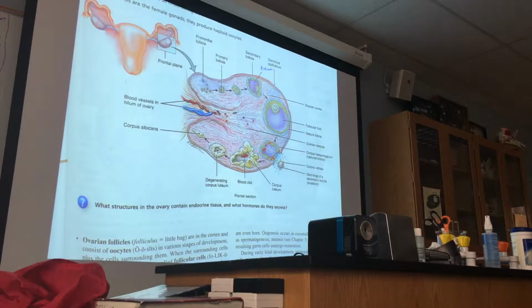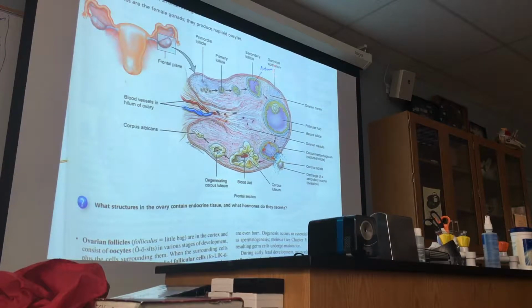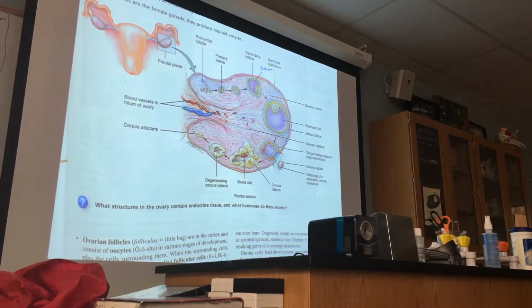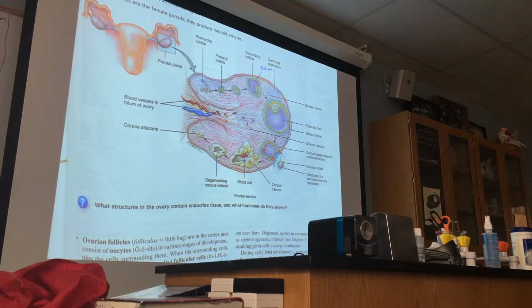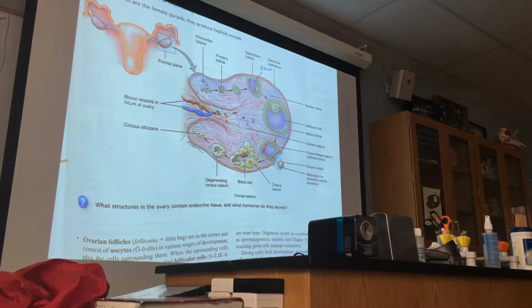There is a limiting epithelium. It's called germinal epithelium. It is squamous to low cuboidal, simple epithelium, but the germinal epithelium is a misnomer. What is the meaning of misnomer? It's named incorrectly. Incorrect name, thank you.